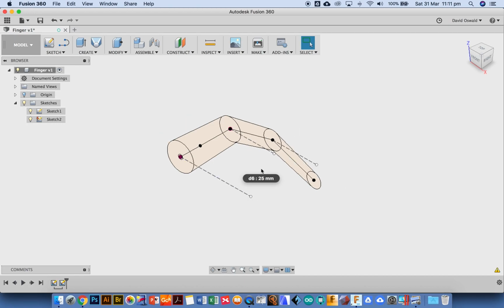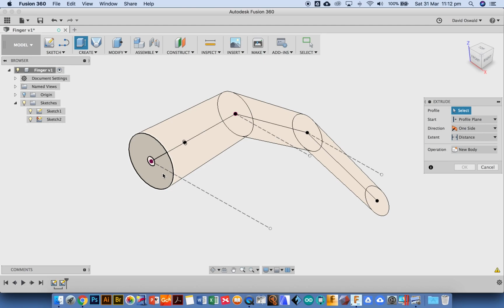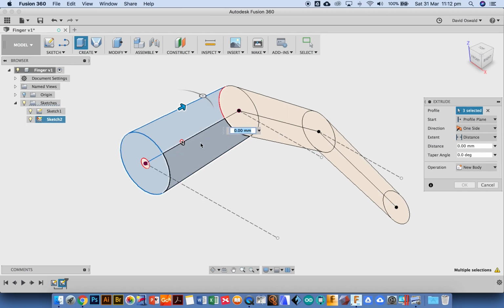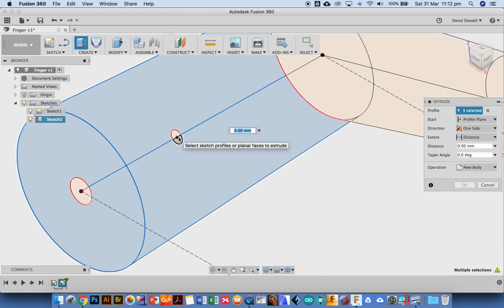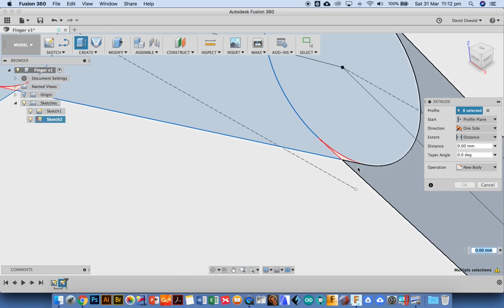And one last stage is just to give the finger thickness to 3 mm, because we would be laser cutting this. So I'm going to go E. And here you've got to grab some segments. I need all of these segments. I need to make sure that that's going to be a hole, so don't highlight those two there. There's a tricky bit up here coming. I'm going to get all these. These little bits in here are the bit you need to zoom in.